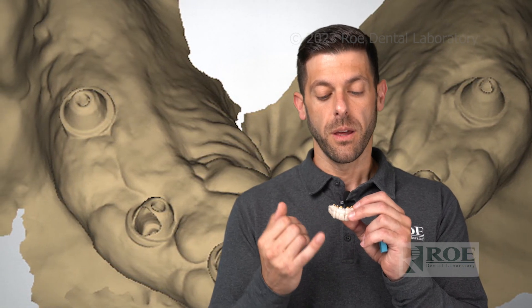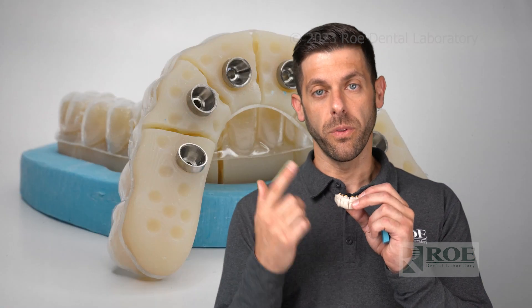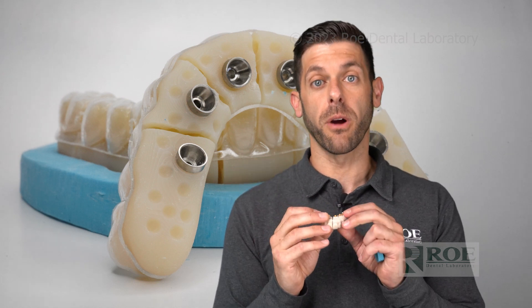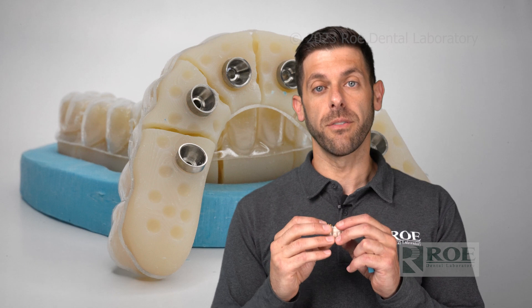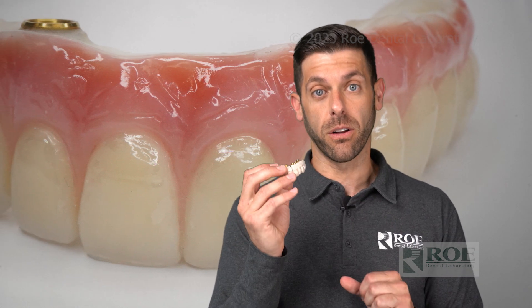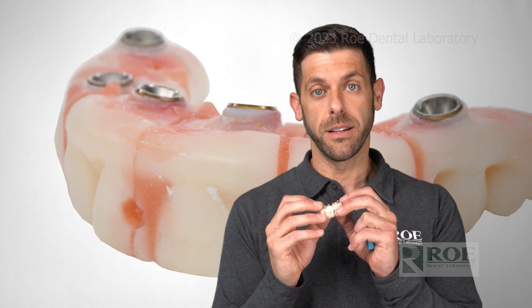Once it's luted together with the opposing and the bite, you send this to Rho. Just print up a UPS label from our website and send it to us. From there we're going to go to a printed try-in and then a final zirconia. Sometimes we can go right to a final zirconia, just depending on the records and how close the iJig was.